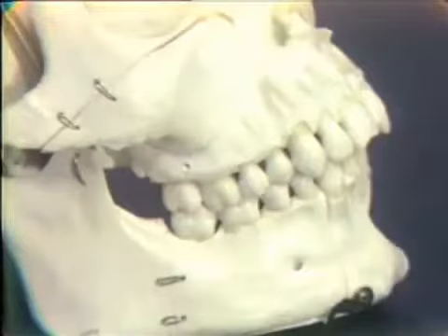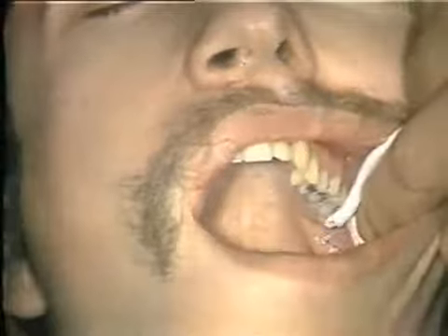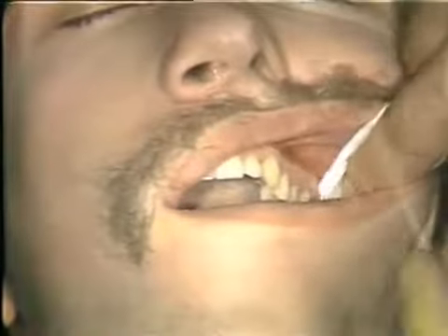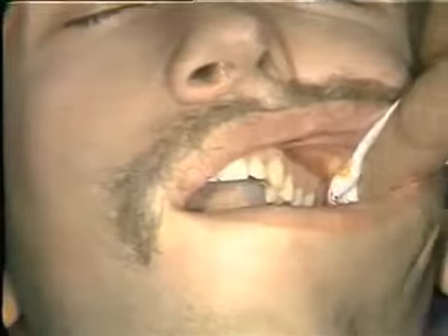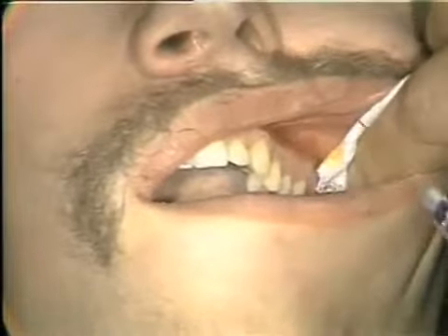All right, let's demonstrate it on the patient. And if you'll open about halfway for me, please. And we might close just a little bit. That's perfect, Andy. I'm drying the mucosa here now. And then we'll apply our tincture of betadine directly above the first molar. Now you'll notice that again with the cheek retracted, how tense the vestibular tissues are.